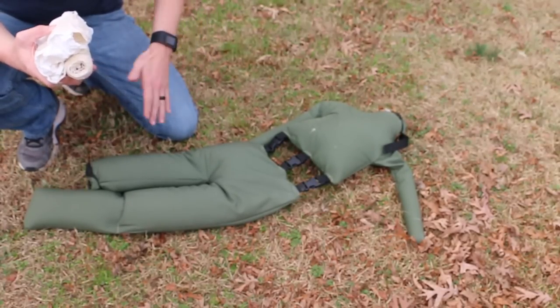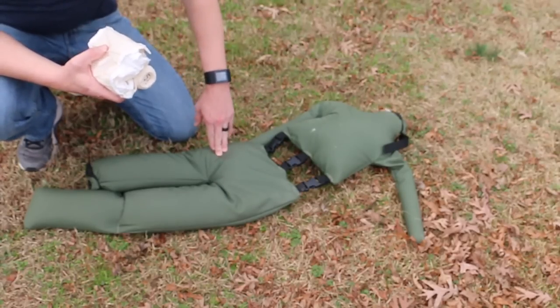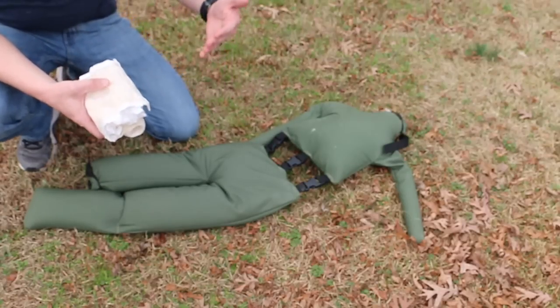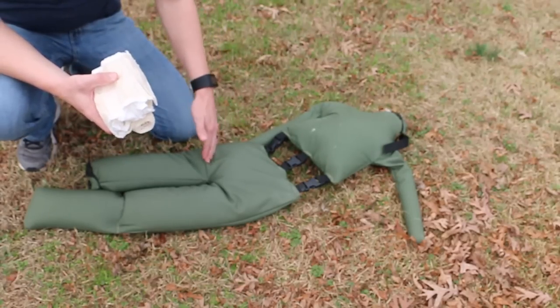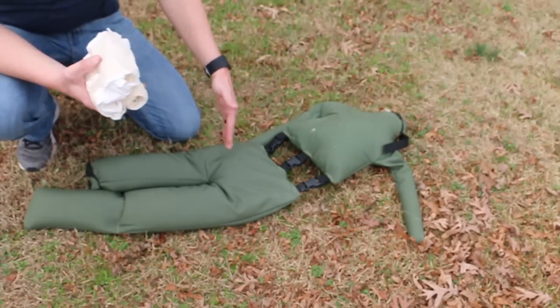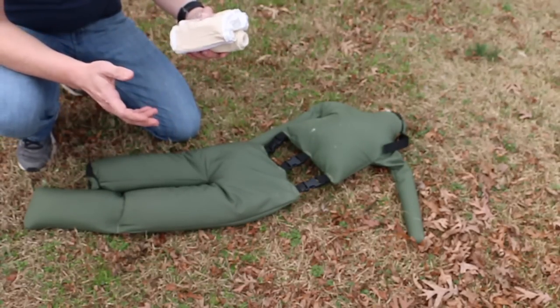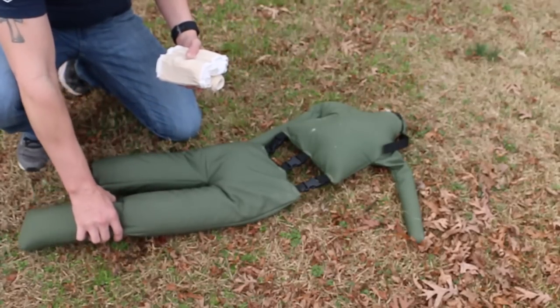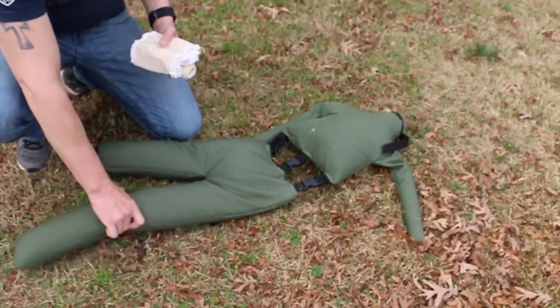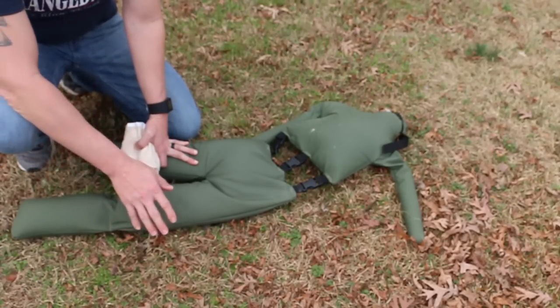Where I like to use a pressure bandage is in junctional injuries - such as up in the groin where you just can't get a tourniquet, or up in the shoulders and armpits where you absolutely just can't get a tourniquet up high enough. You wound pack it first, obviously, and then put the pressure bandage over the top of it. You can use it for multiple purposes - this thing has tons of uses. Let's say we have a nasty wound on this leg - a nasty wound that's not squirting blood, that we don't need a tourniquet for, but we want to control bleeding.